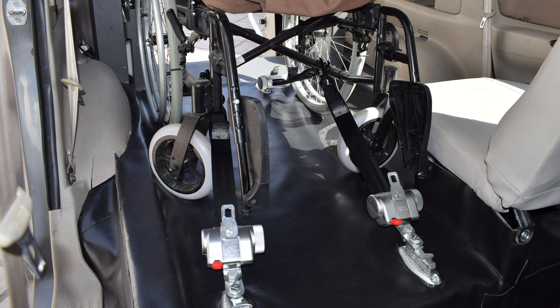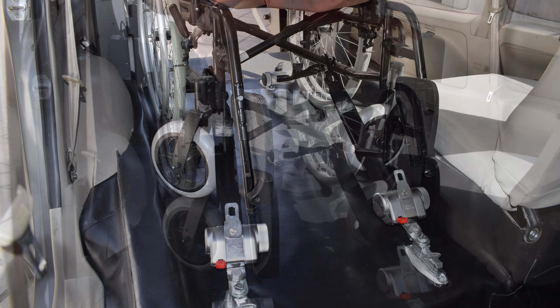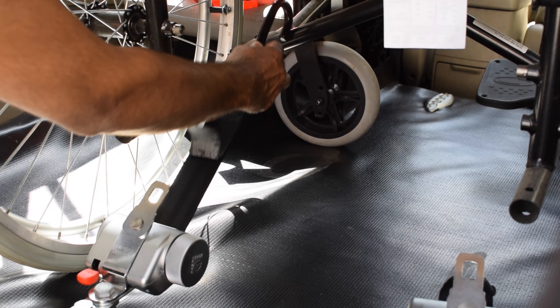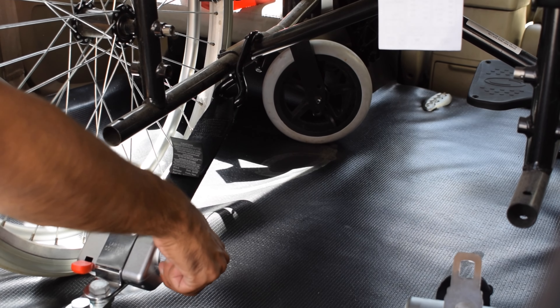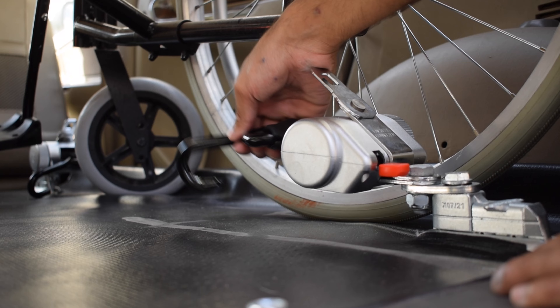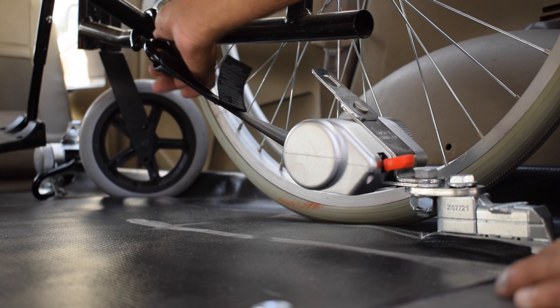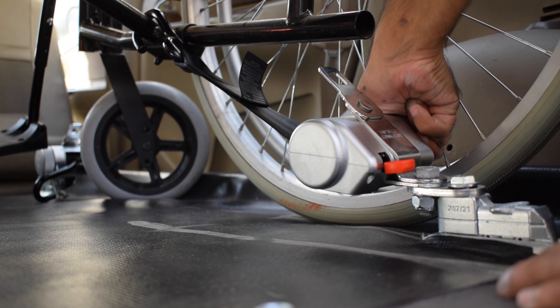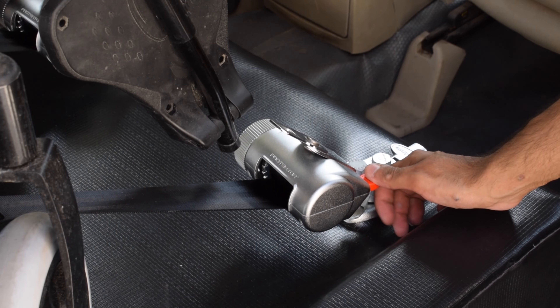These locks are removable so when you enter with your wheelchair you can also remove them; there is a socket placed on the floor of the car in which they go and sit. This docking system works with the given hooks. You place them on your wheelchair and rotate the locks clockwise to generate pull from front and back. Press the red button to unlock the docking system and release the straps from the wheelchair.